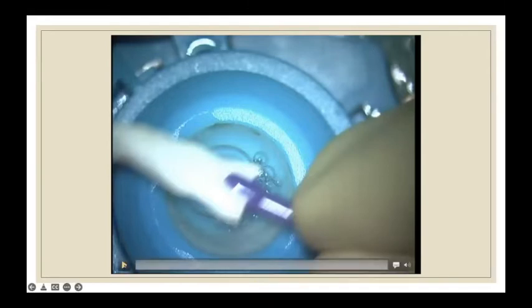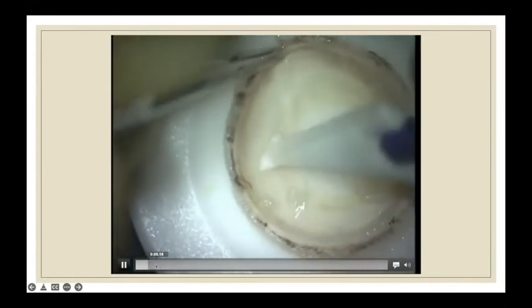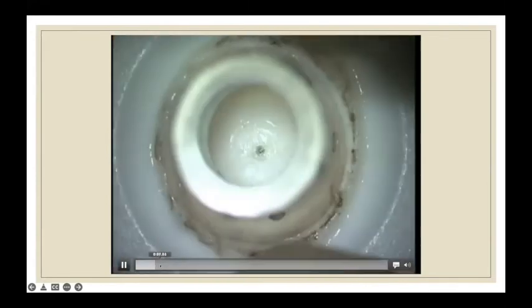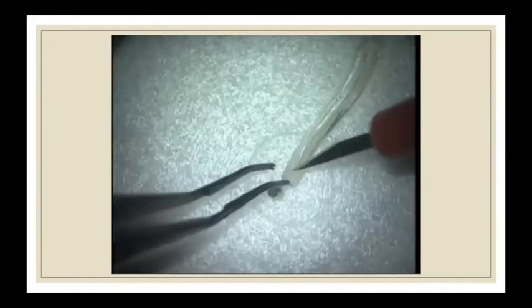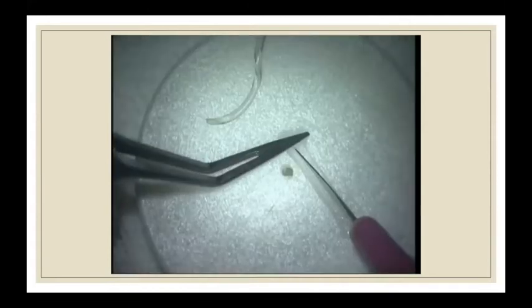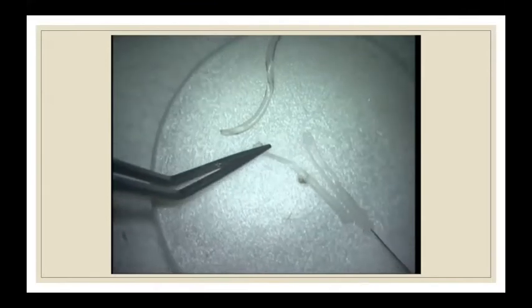Here is yet another video where, again, I show the epithelium and endothelium being removed and the trephine being placed. These trephines are available in different sizes, so you can alter the amount of corneal tissue that is being placed into the cornea. Here, I've also taken this segment of corneal tissue, and you can actually split it further into two. So you can get various different sizes right from the trephine itself.